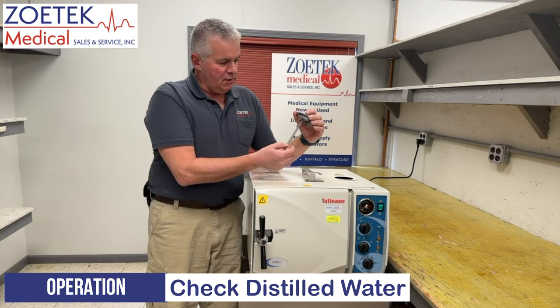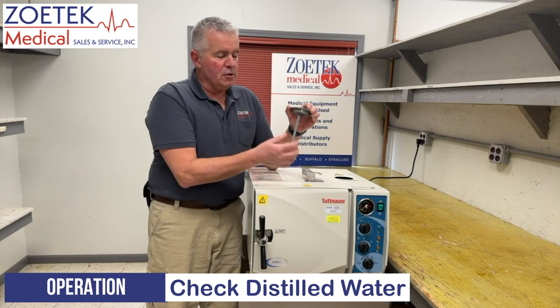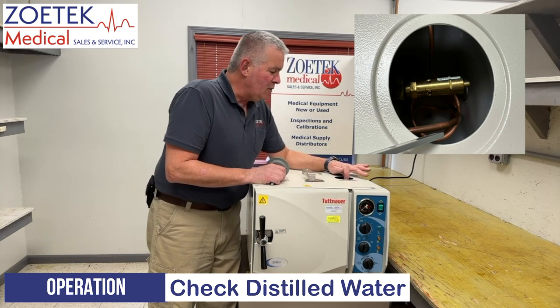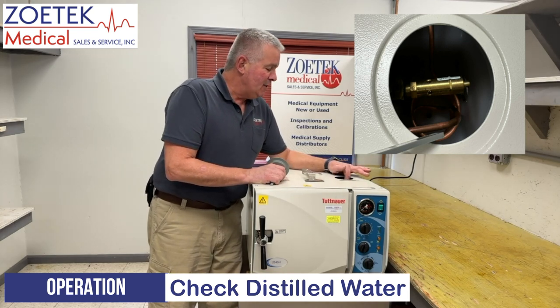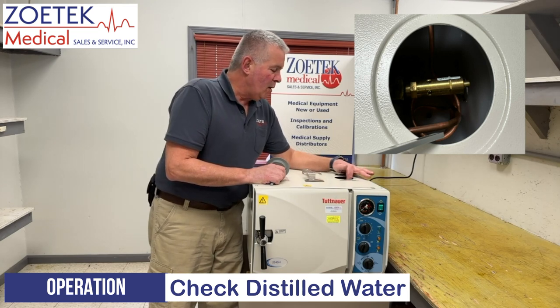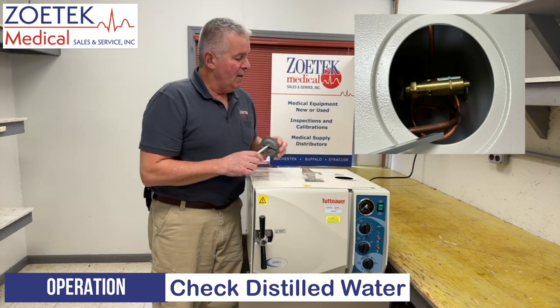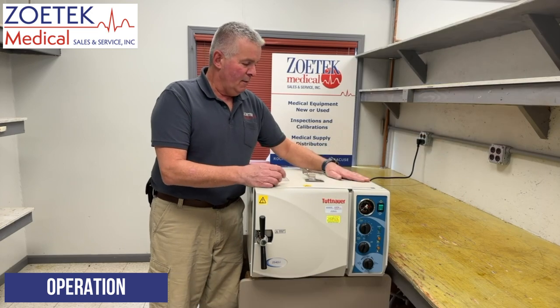I find it difficult to see the water level because the water doesn't leave a really obvious mark. So what I like to do is look down inside here — just a couple inches down from the top there's a cylindrical valve with what looks like a keychain ring on it, and that is our safety valve. When we put water in here, we want the water to be up just to the bottom side of that valve. That would be a normally full water level. Again, only distilled water. Then we put our cover back on.